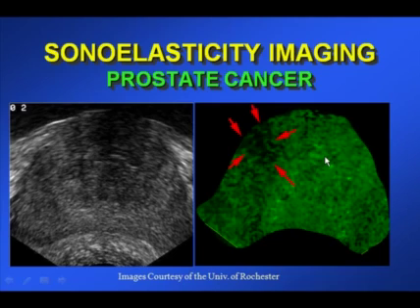This method of imaging depends not only on the stiffness of the material but also on the viscosity of the material. So what we call the viscoelastic properties of the material are being tested here. But it is a good method for detecting stiffer materials alone.